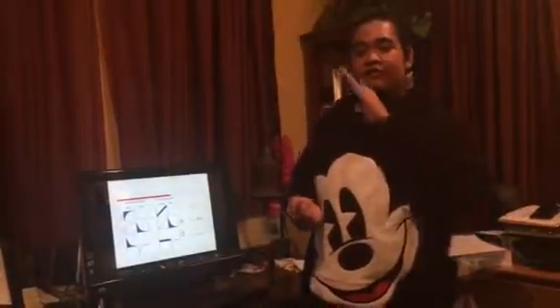As for volume control, the pressure is more of a shark fin because it gradually goes up. So think of it as the roller coaster. When the roller coaster is going up, it's building up that momentum to go into the pressure that the patient needs before it cycles off to exhalation. So that's basically it for pressure. And then I'm not really going to talk about volume because there's not really any difference, so we'll skip that and go with the flow.